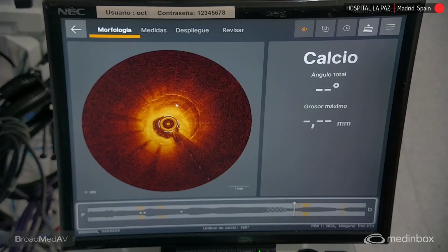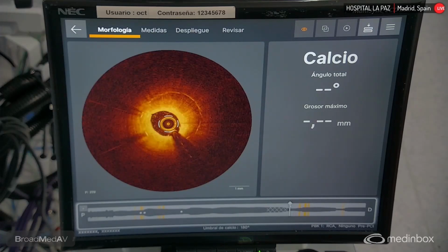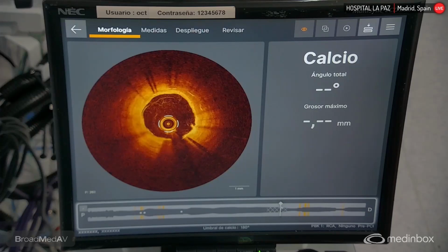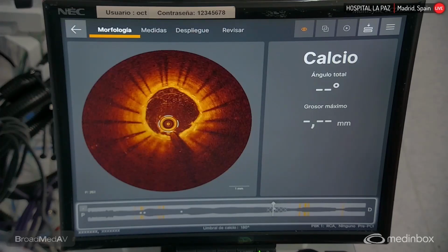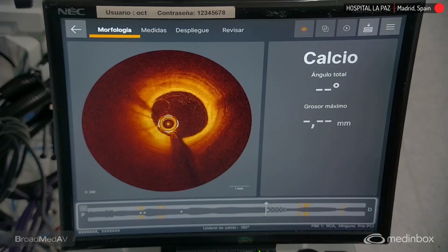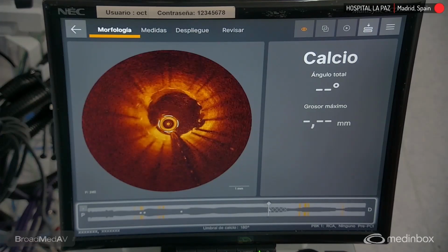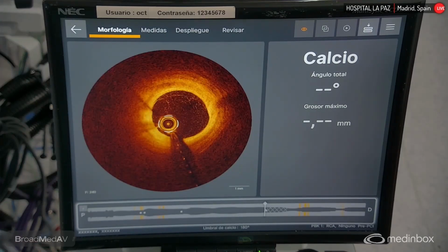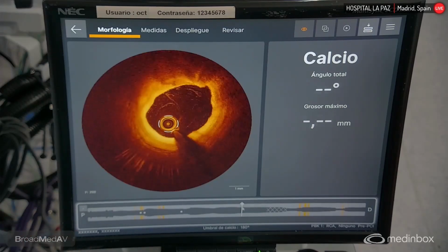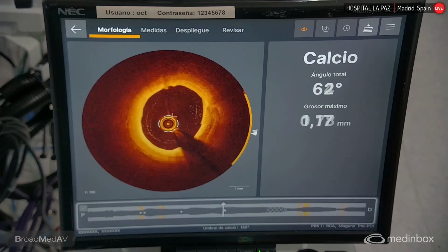And this is the most severe region. Probably there is also calcification in this point. There's a lot of fibrous tissue also. And we have seen with the predilation that there was a very strong lesion. So we will use laser excimer to prepare this lesion before high-pressure balloon predilatation and stent, if necessary. The other option is to perform finally only balloon with a drug-eluting balloon.